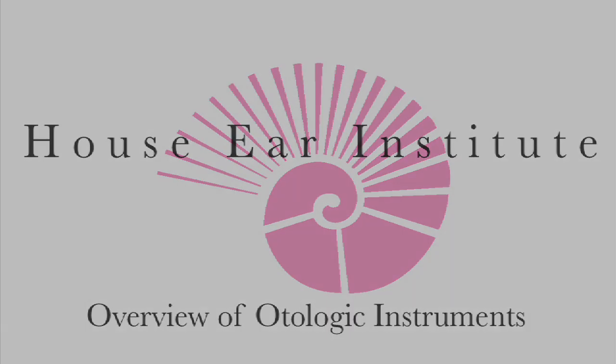Hello, I'm William Slattery of the House Clinic. In this video, we'd like to review the more common ear instruments, reviewing their names, their usage, and a little history about each of the instruments.